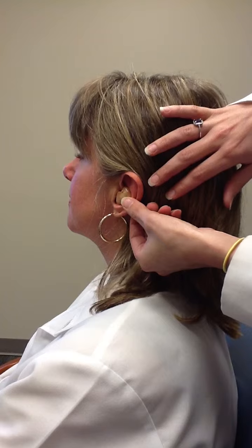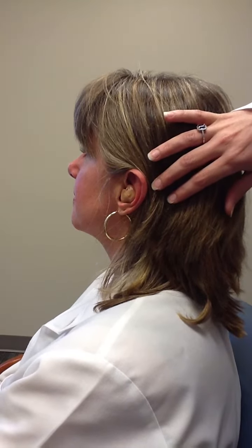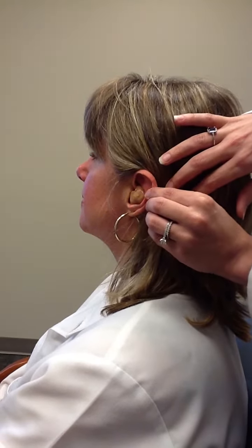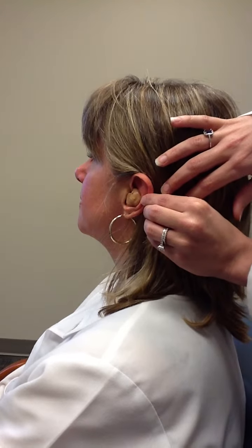This is what the hearing aid should look like in the ear. Now, everyone's ear canals are a little bit different. Some people may not need to do the twist, and other people may need to pull up on the earlobe when inserting the hearing aid. You need to find out what works best for you.